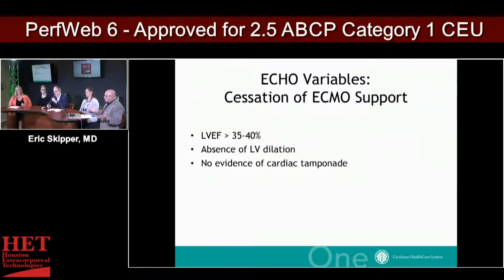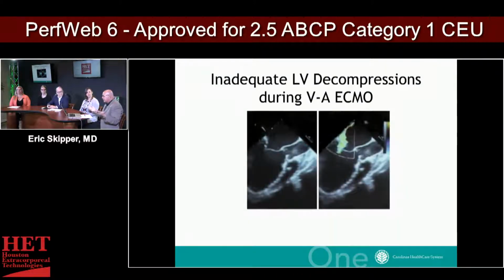Yeah, most of ours are going to be not central and peripherally cannulated. Most of ours are going to be that way. So if the chest is already closed, but you have somebody in refractory lethal arrhythmia, PEA or whatever it may be, took them to cath lab. They can't figure out what to do for right now. They're on VA ECMO, but the heart's distended. I mean, that's really our only option.